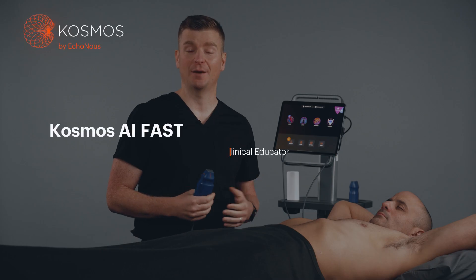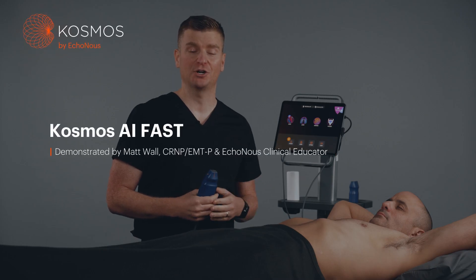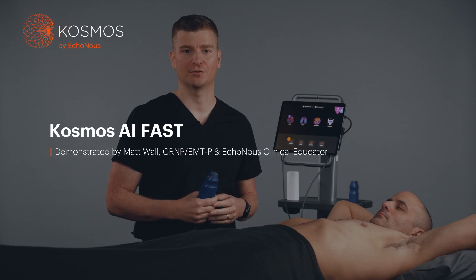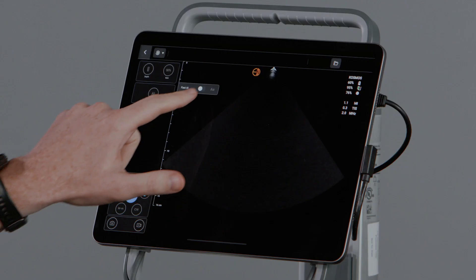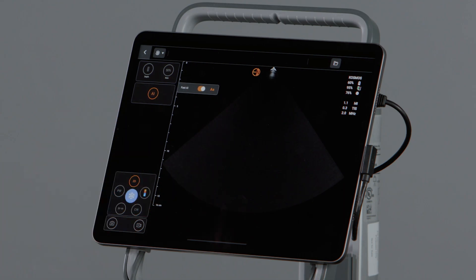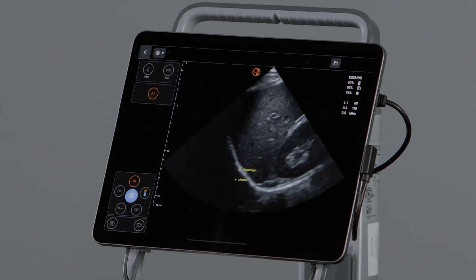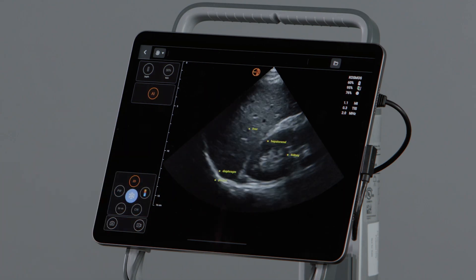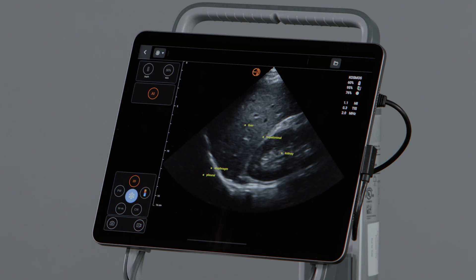Hi, my name is Matt. I'm a nurse practitioner and clinical educator here at EchoNous. I'm going to show you how to use the AI-FAST feature in the abdominal preset with the Kosmos Torso-One probe.